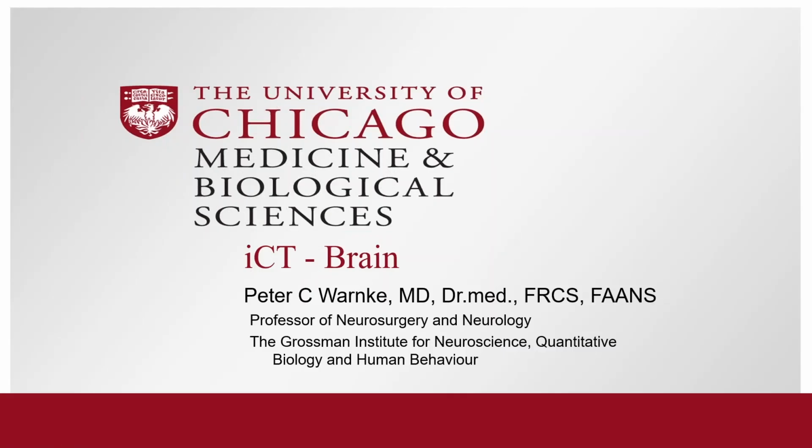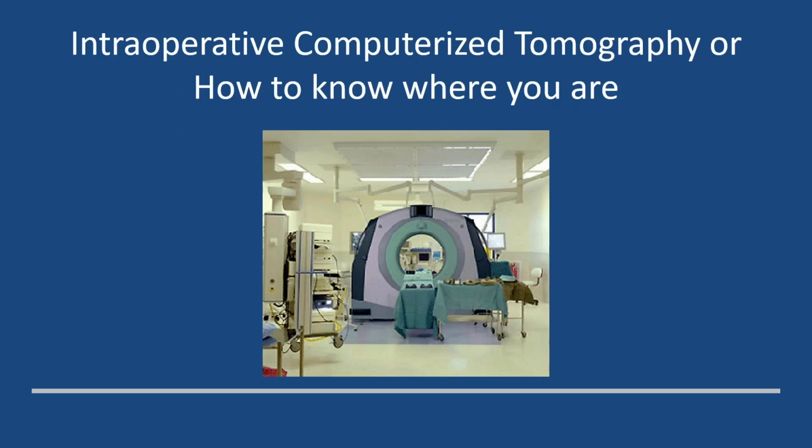Yes, so I'll talk about the intracranial applications of intraop CT, and I've been using that for 20 years, starting with stationary MRIs, and recently in 2013, when the body tom became available, we used that. The whole point is, like spine, that you want to know where you are whilst you do a procedure, and the body tom or any intraop CT with a wide bore allows you to do that.